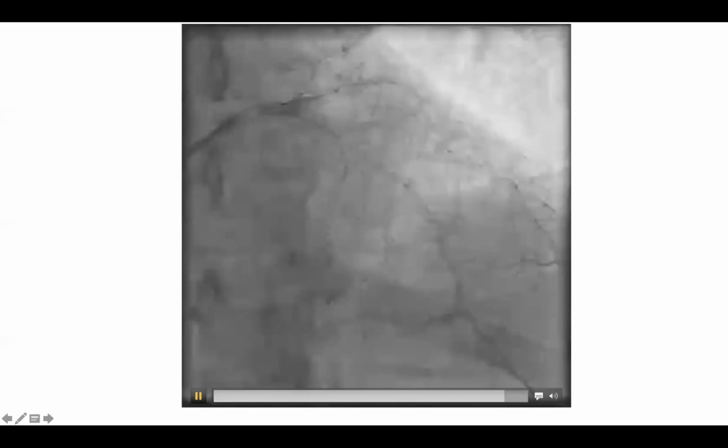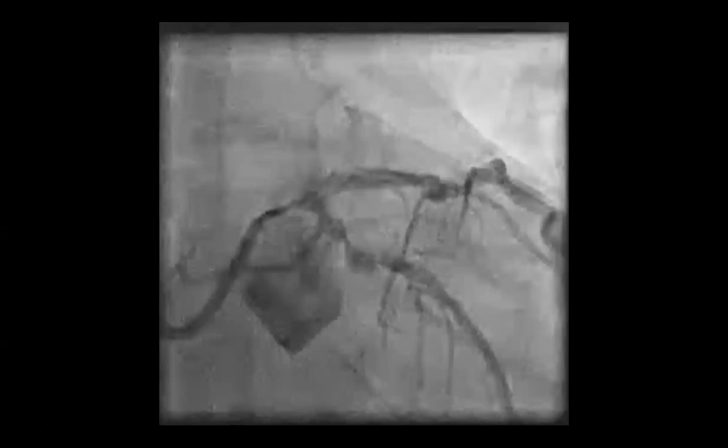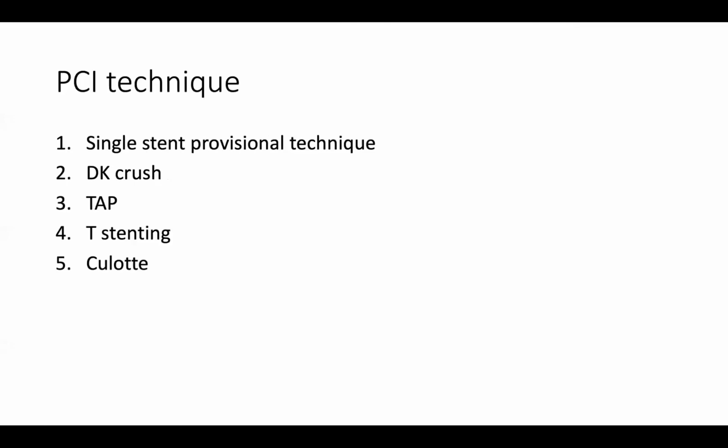Show the caudal picture, please. AP caudal or PA caudal. This is a PA caudal. Yeah, this is a good picture, yes. I think we can see there's critical left mainstem disease and disease running into the ostium, certainly of the circumflex. And it looks like probably the LAD's involved as well. Yeah, so it's probably a true 1-1-1 bifurcation here, isn't it?